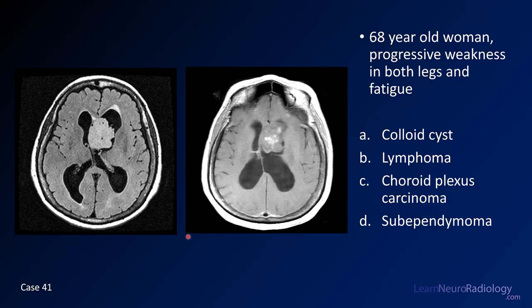Case number 41 is a 68-year-old woman with progressive weakness in both legs and fatigue. We've got a FLAIR image and a blurry post-contrast image here. Your choices are colloid cyst, lymphoma, choroid plexus carcinoma, or subependymoma.